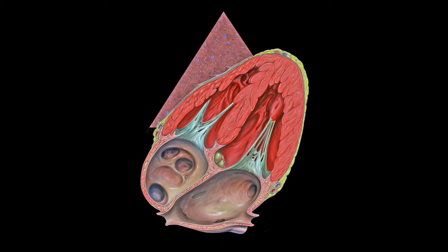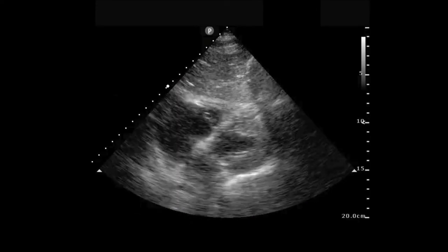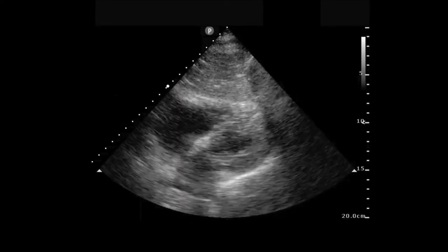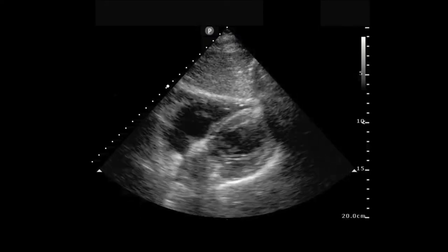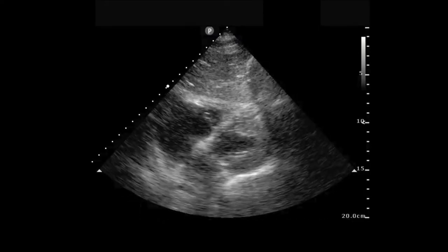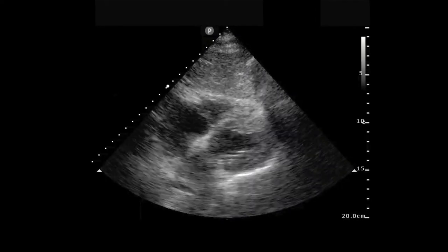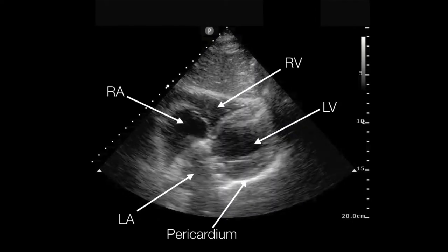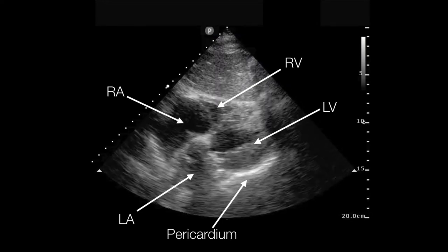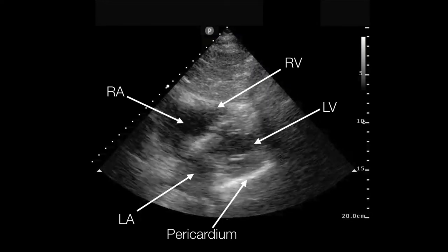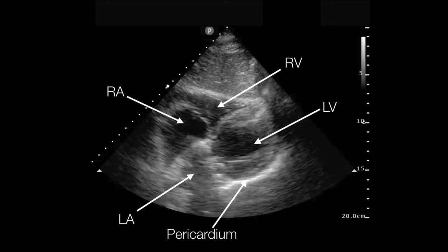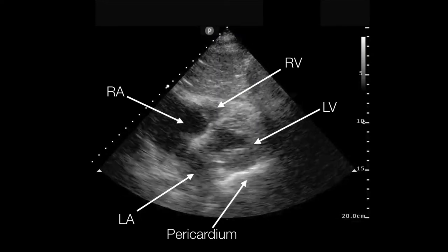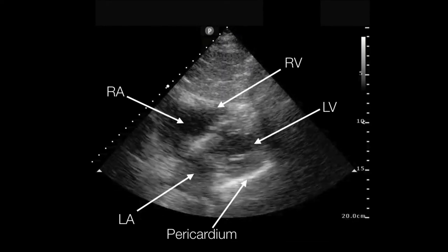The liver is very echogenic and transmits sound very well — it's a great window to look at the heart. You'll see the base or apex of the heart. In the subcostal view, looking up toward the heart from underneath the xiphoid process, we can identify the left atrium, right atrium, left ventricle, and right ventricle. The bright white line surrounding the heart is the pericardium.